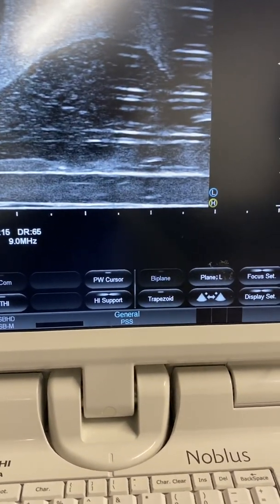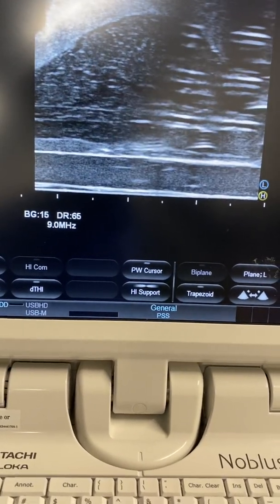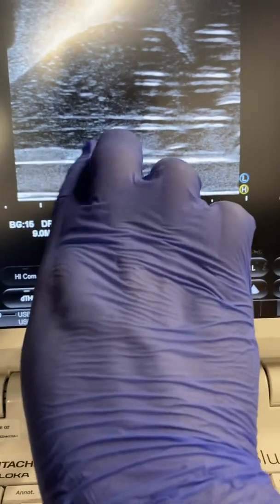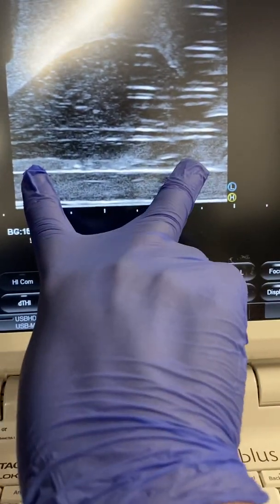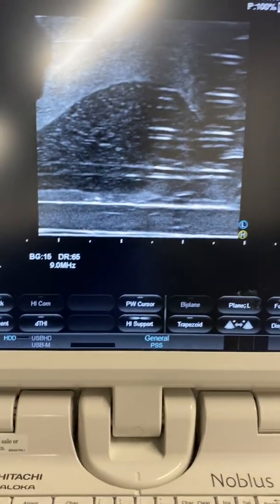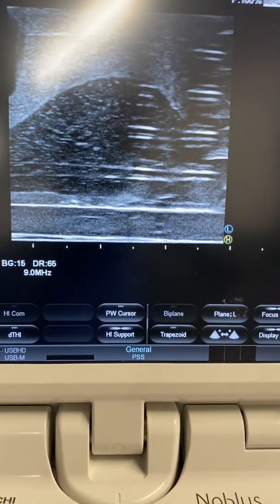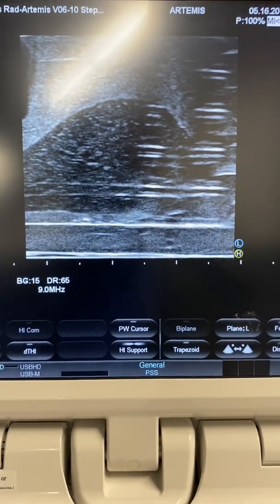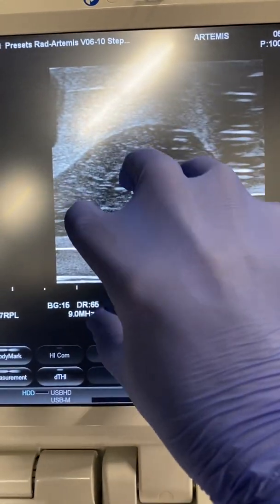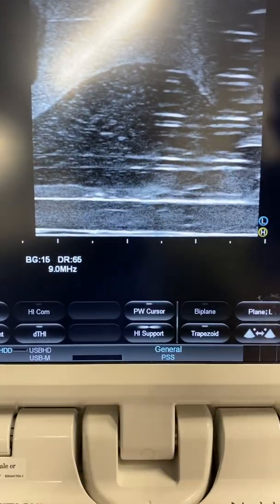Once ready to inject, they'll push both syringes at the same time. You'll see a spread of fluid in the space get bigger and bigger, widening the space — you'll see it start growing. They'll be counting through the 10-second injection. When they get to 10, all the gel has been injected, and you should see a kind of flash as it all hardens. Then they'll take the needle out.